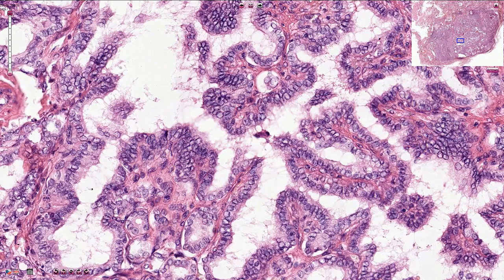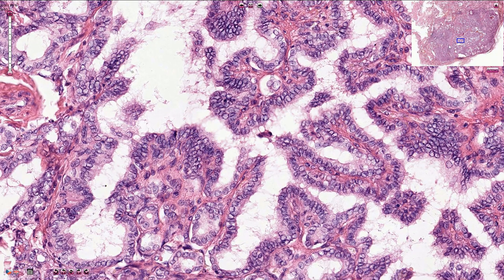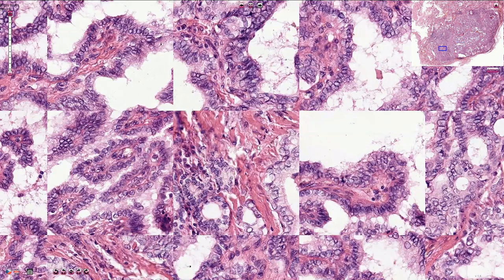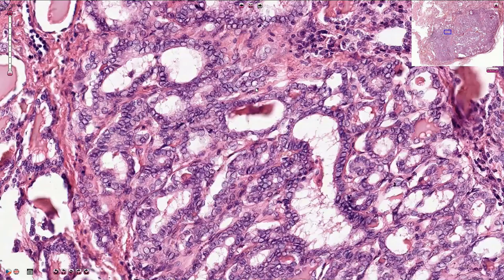Moving to the follicular area of the tumor, we don't see papillary structures here — instead we have follicular structures where we can still appreciate the typical nuclear appearance: enlarged nuclei with longitudinal grooves, nuclear membrane irregularities, clear empty chromatin, and overlapping.